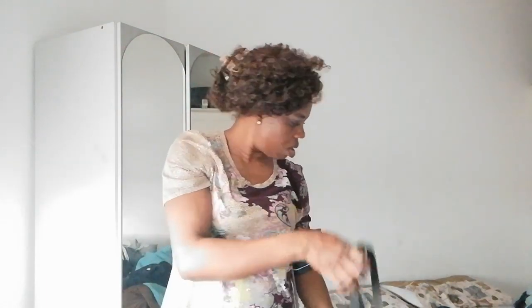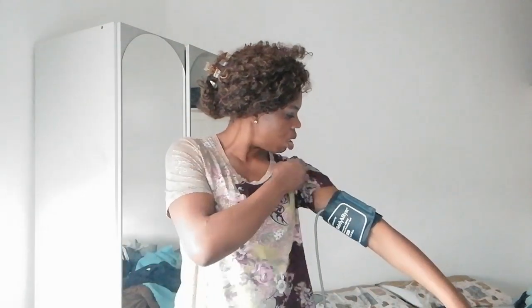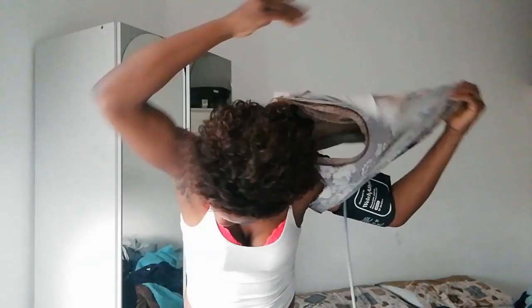Oh my god. Okay, first of all, drop it on the bed. I'm going to remove this one. Okay, this can be removed — yeah. I'm going to pass it through all this.